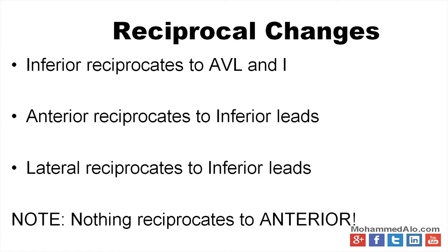Now, if you note, nothing actually reciprocates to the anterior leads. This is very, very important. Nothing reciprocates to your anterior leads. If you ever see ST depressions in your anterior leads, that's a posterior MI. Nothing reciprocates there. You cannot have ischemia in your anterior leads. Ischemia does not localize. I want to stress this.